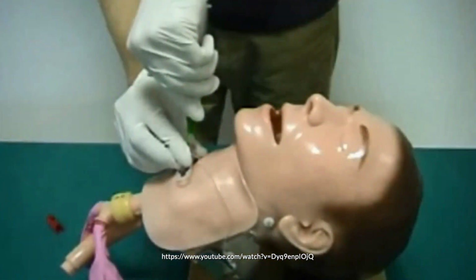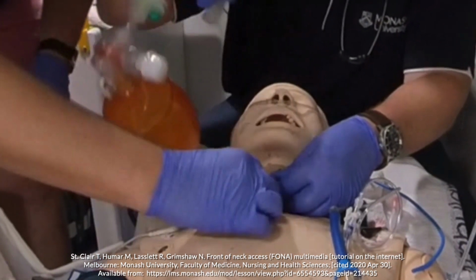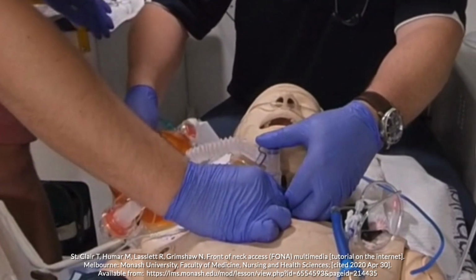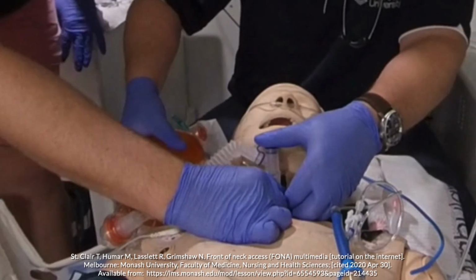Once this is done, remove the metal needle, inflate the cuff with 10 mL of air, and attach the BVM to the cannula. Deliver initial ventilations to confirm placement via capnography. Successful placement can also be confirmed by checking rise and fall of the chest, air entry on auscultation, and improvements in SpO2 and skin color. Once confirmed, you can secure the Quick-Trach 2 with a foam neck tape.